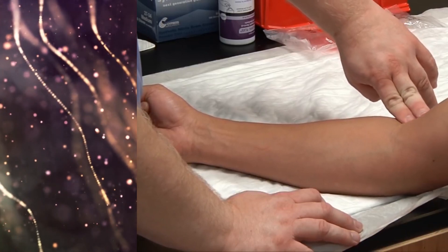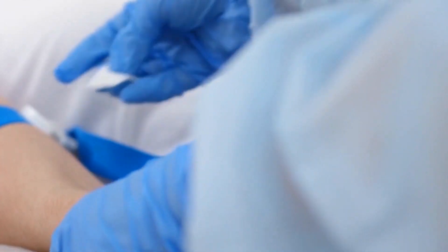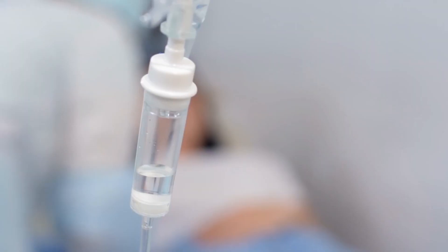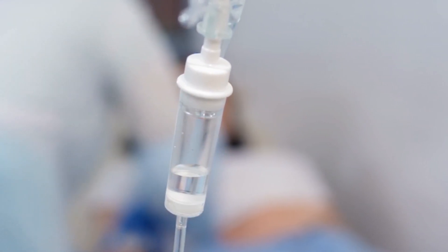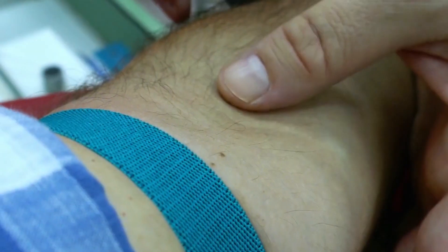Locate the puncture site. Apply the tourniquet on the participant's arm 3 to 4 inches above the venipuncture site. Locate the vein and cleanse the area with an alcohol wipe, wiping in a circular motion and making sure the area is thoroughly clean.